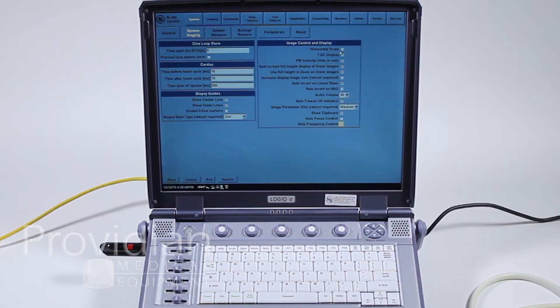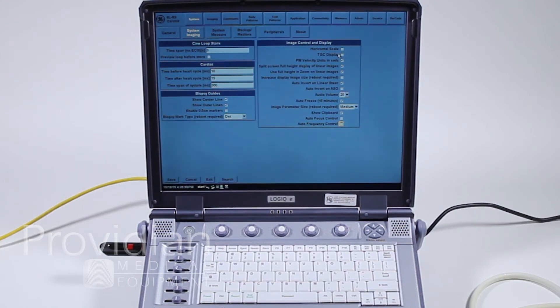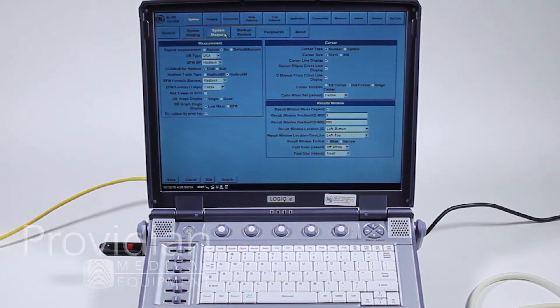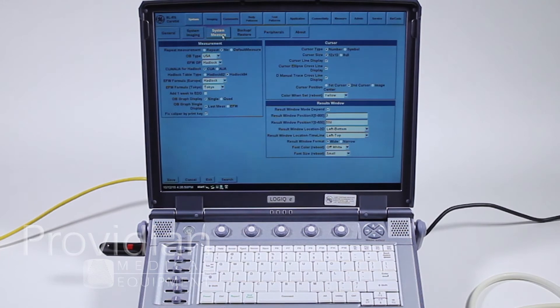This is for cardiac with an ECG attached, how much time you want before or after the heartbeat. And then again, some other ways of how you're going to view things on screen. I recommend you just look through to see all the different things you can change because you can pretty much change everything on the system and customize it.